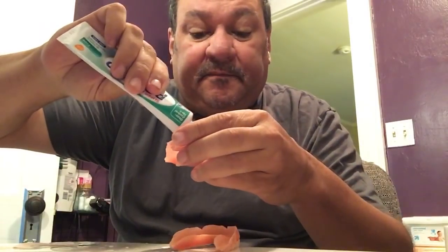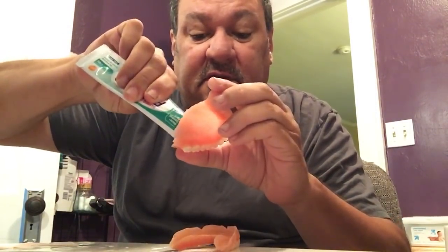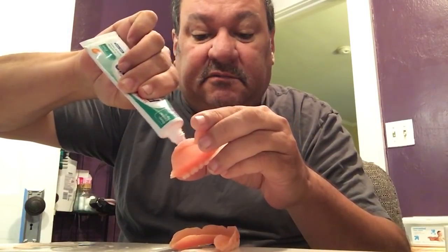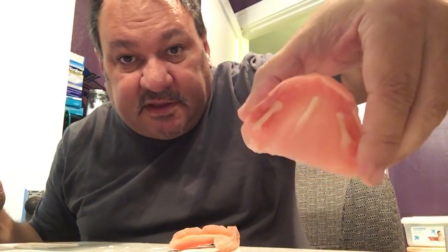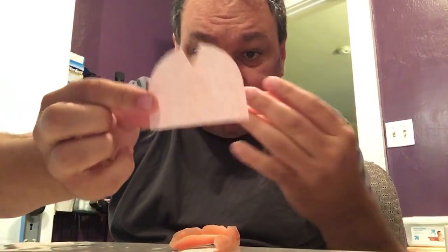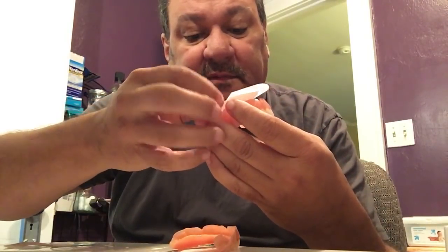It really doesn't matter which adhesive you use. I put just a little — right there, right there, and right there — three small little strips. Then I take my wafer and I line up the bottom edge so it goes on this edge, like that. I don't do any trimming.